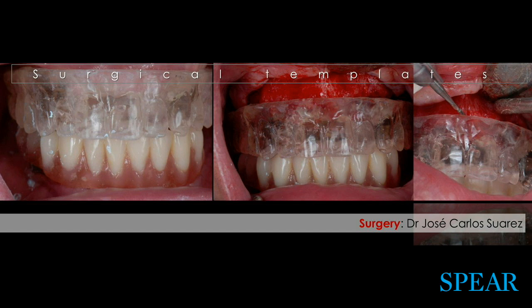The next item is how much bone do we need to remove? As you'll notice here, we have a mark at 18 millimeters. The surgeon knows how much he needs to remove, and so we're now playing a sure game.